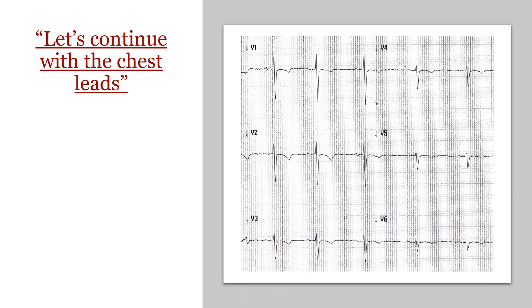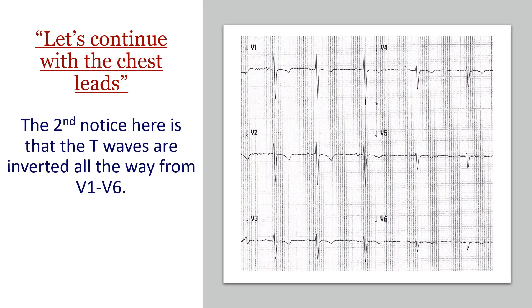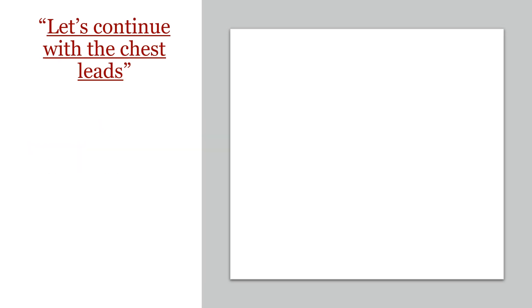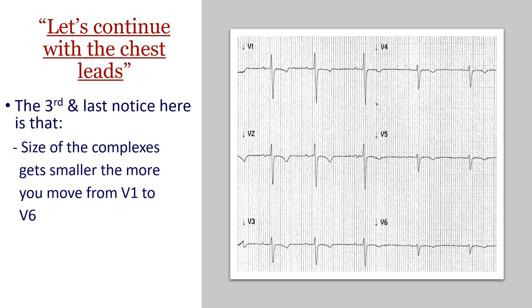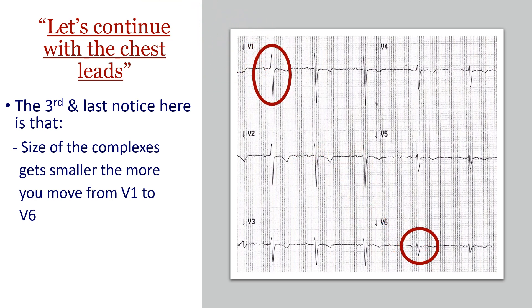The second thing to notice in the chest leads is the T waves — they are all inverted from V1 down to V6, which is abnormal. The third finding is the size of the QRS complexes. Assessing from V1 all the way to V6, they are getting smaller and smaller, as if you're moving away from the heart — V1 bigger than V2, bigger than V3, all the way to V6. Again, clearly abnormal.